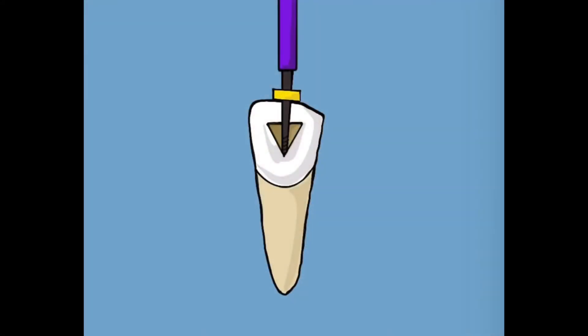Working length is the distance between the reference point coronally and the point at which canal preparation and obturation should terminate.